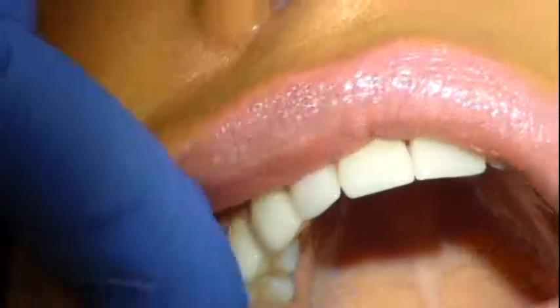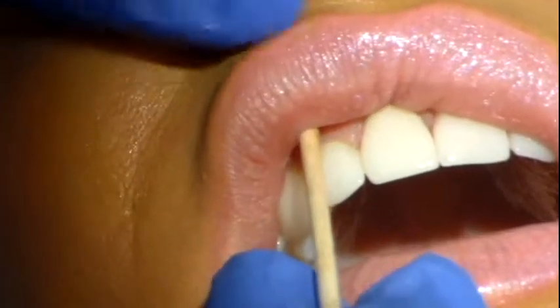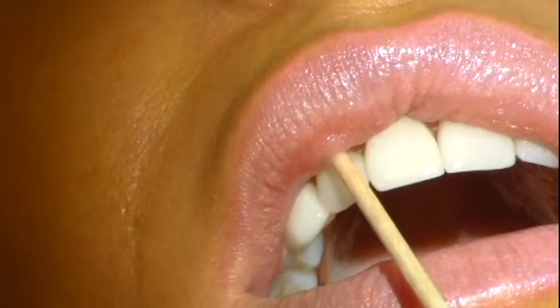It's been debrided. We're going to apply the topical, and we're going to let it sit for a minute. And the ASA gets the canine, the lateral, and the central on the side of injection, with a little bit of fade out at the very center.